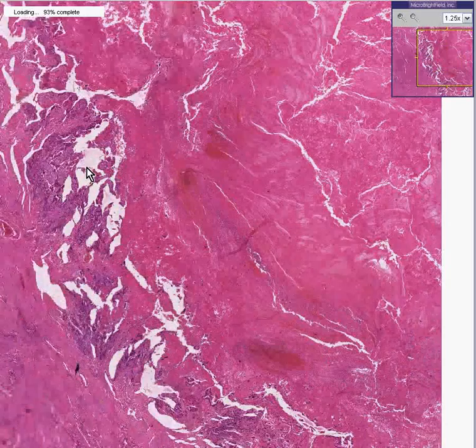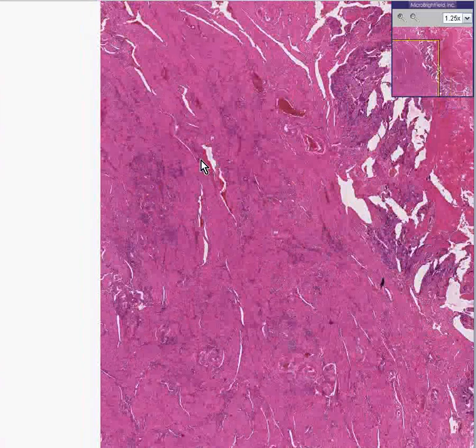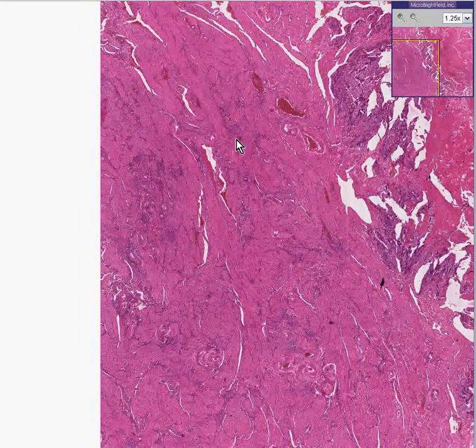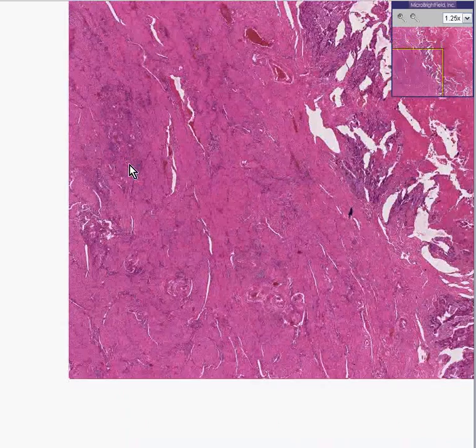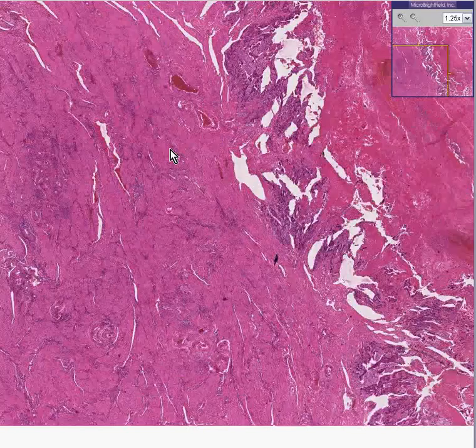Let's take a look at some of the tumor here that's invading the myometrium, which is of course where a choriocarcinoma might be expected to go because that's what it's next to. Also notice there are little invasive nests out here.